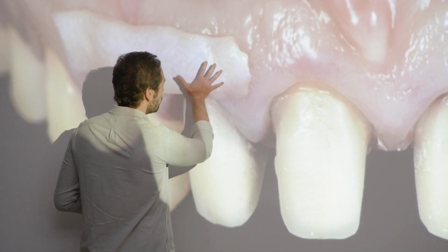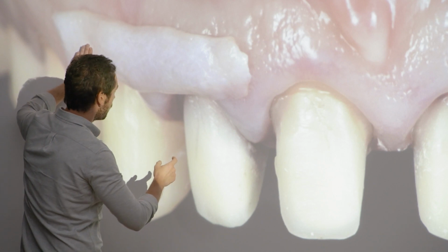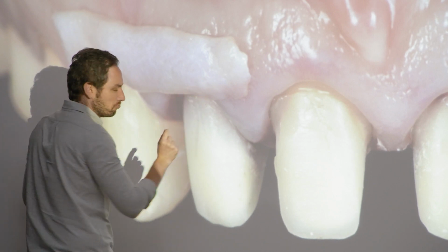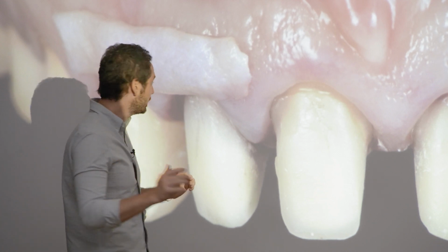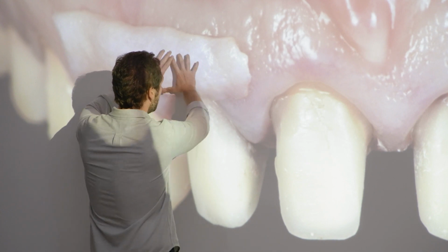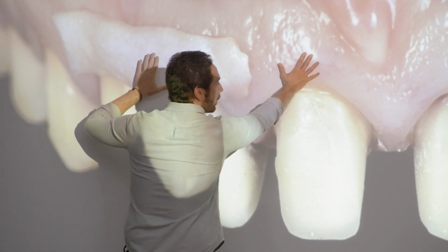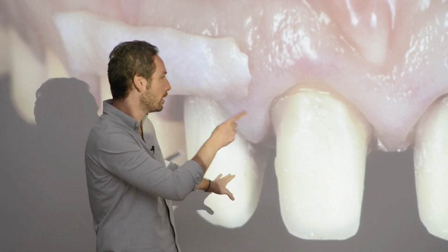So in order to block the color here, there, and to bring the tissue down here, I need like 1.2 millimeters of soft tissue, which is more than enough, but I need to create space for the graft, because otherwise I will be like here with a lot of tissue, here different profile, and everything is going to be really strange. Go back one picture.